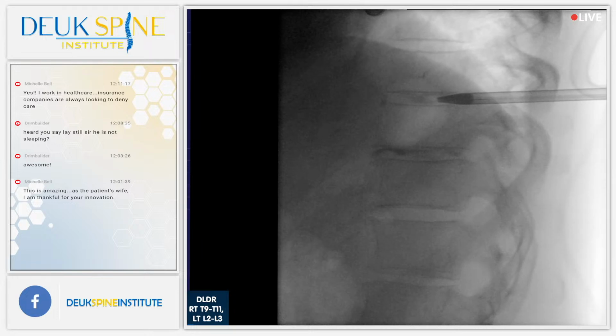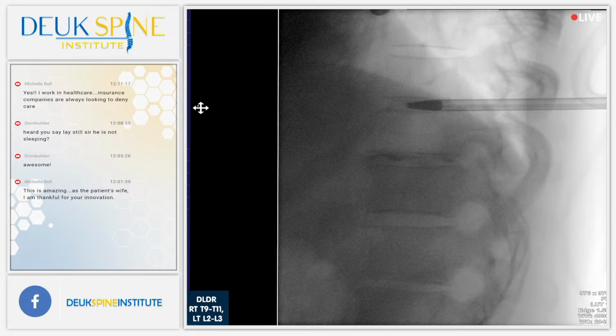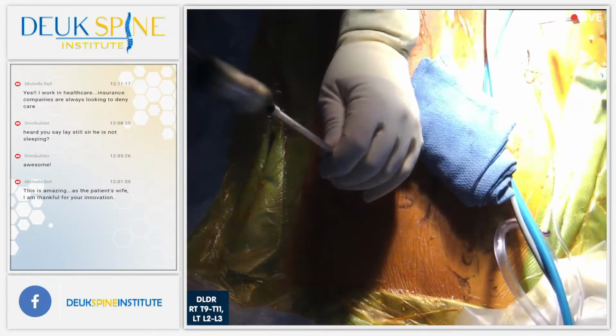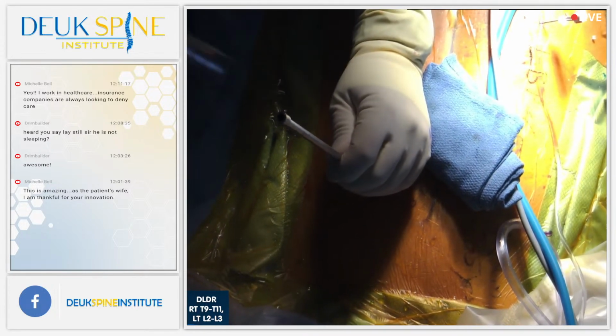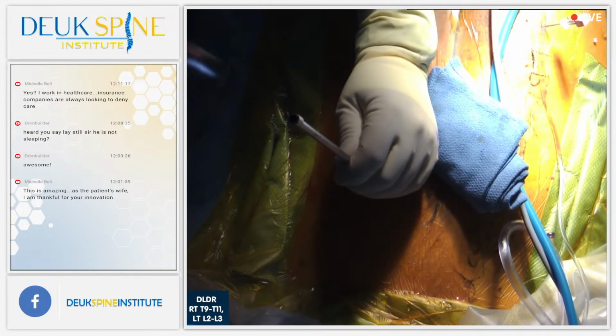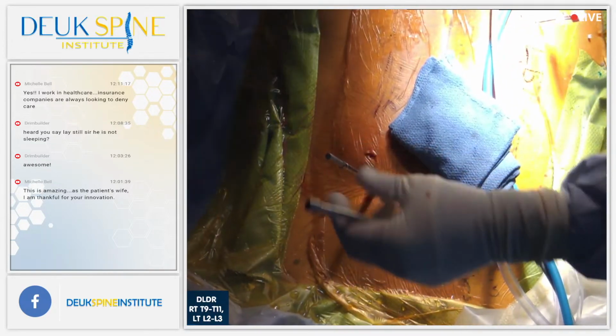Shot? Wow. That is a tough disc to get into. You're very scarred up. So we have one disc fixed, we have one thoracic disc fixed, we have one more to fix, and then we're going to go lumbar. I think that's pretty damn good right there. Maybe 1 more millimeter or 2. That's perfect. Thanks, Luis. Any more questions?